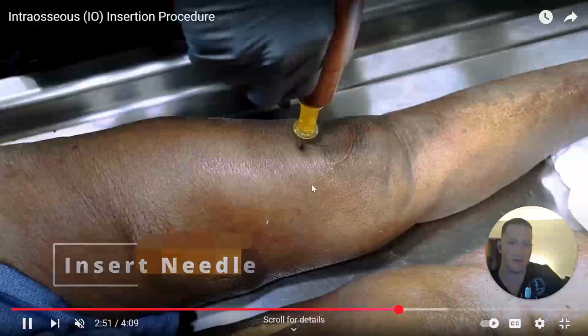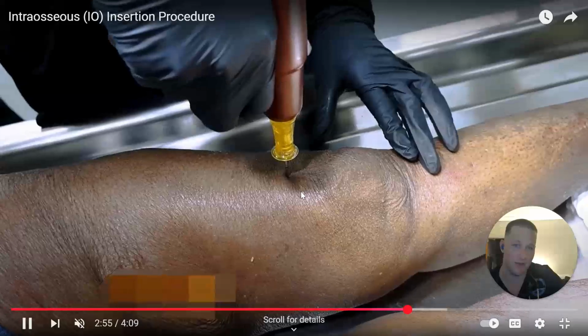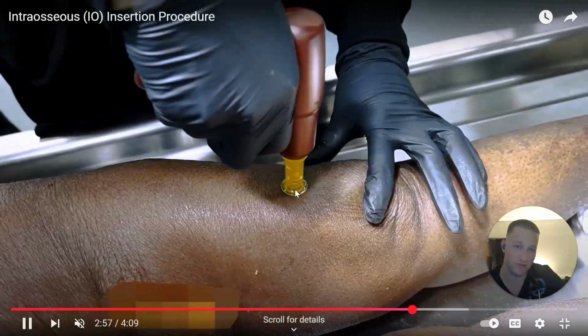So here's what they're going to do. They're going to put it down. They're going to go down to the bone. They're nice and stable. See how he didn't gun. Now he's going to gun. See how the skin got caught up there?